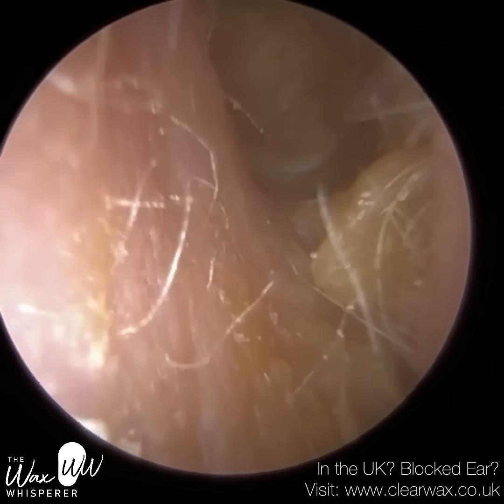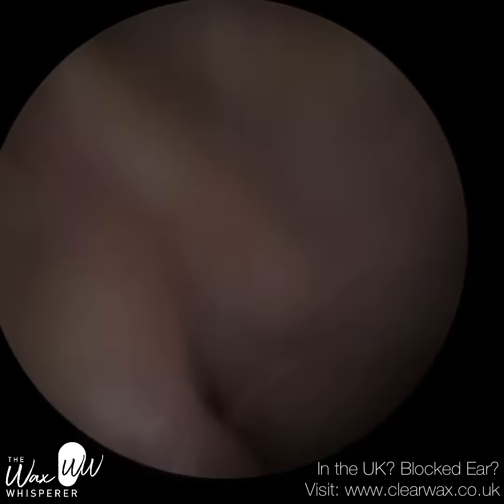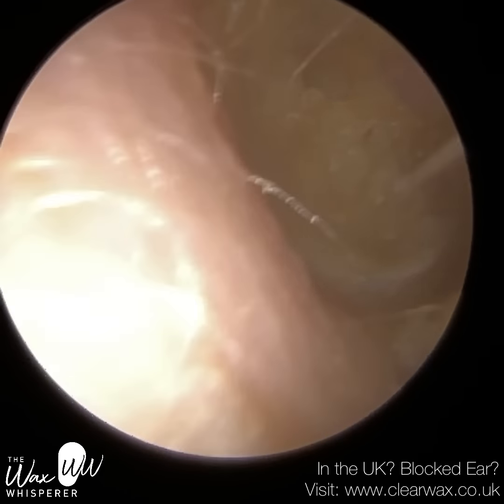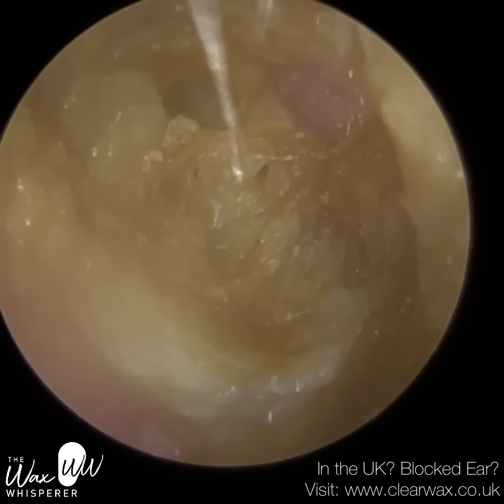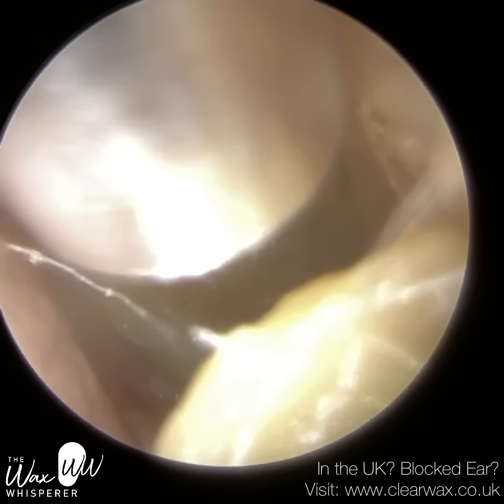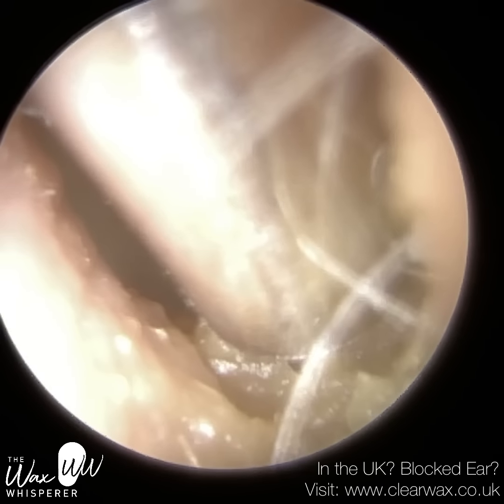Hi everyone, this is Mr. Neil Wright, also known as the Wax Whisperer. Thank you for joining me in my latest video. This is of an elderly patient who attended with bilateral blocked ears. And as you can see, they have got very medial impacted earwax.